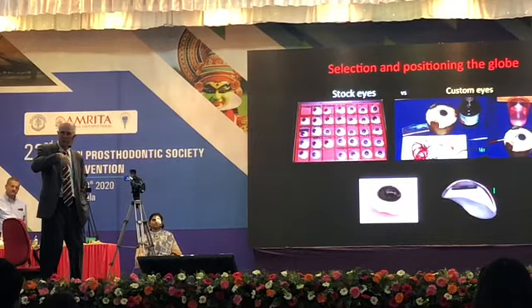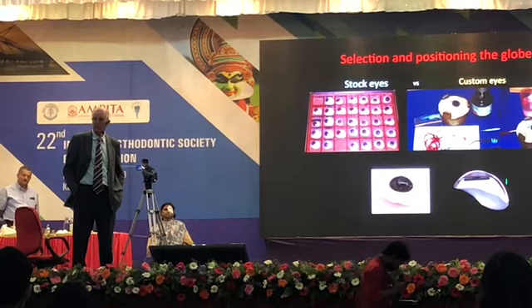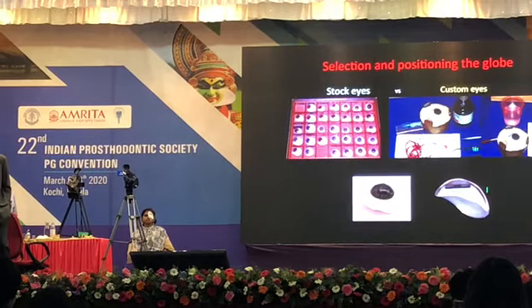And the globe is so small that we can't show the scleral part of the eye laterally the way she does with her normal eye. So everything has to be perfect for an orbital prosthesis to work properly and to look good. And the pictures I've shown you, those are perfect cases. It has to be perfect.